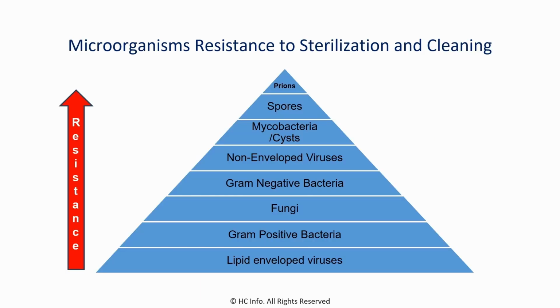Not everything gets sterilized as easily as other things. So there is actually a hierarchy on what is more difficult or what could be more effective. You could think of you have some metals and you get 80% of the sterilization done, or 70%, or 95 instead of 100% of the validated cleaning done. Different things can pop up as surviving that sterilization or cleaning process.